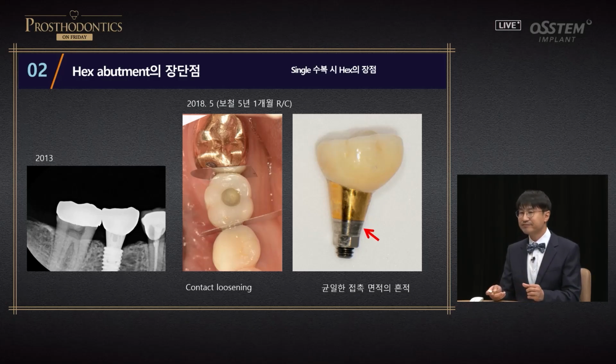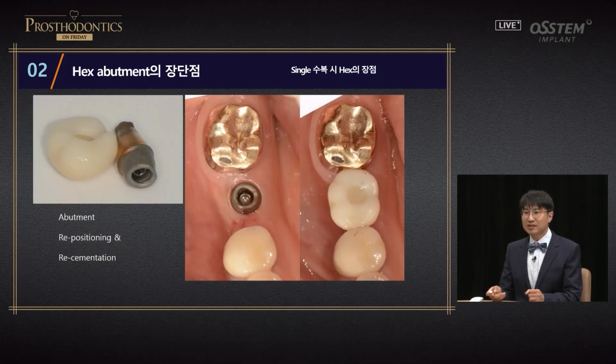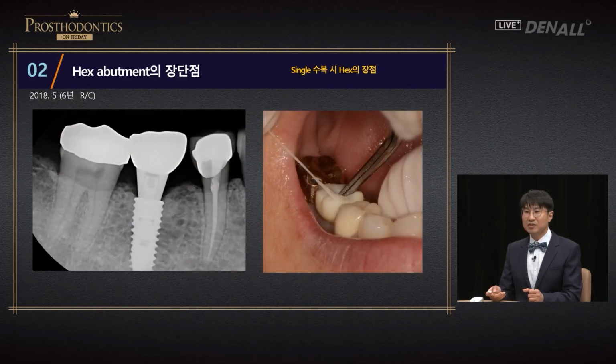After adjusting the contact using hex, it was repositioned and re-cemented. I think this is the biggest benefit of hex. You can position it to its original position. This is the biggest advantage.